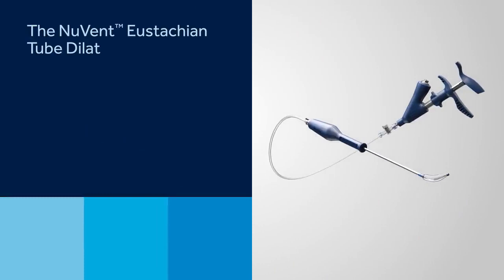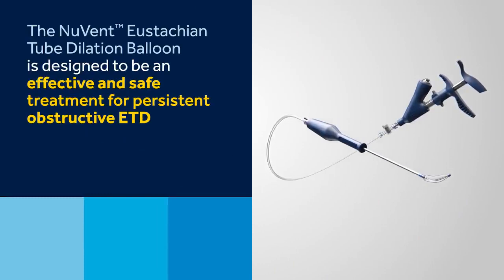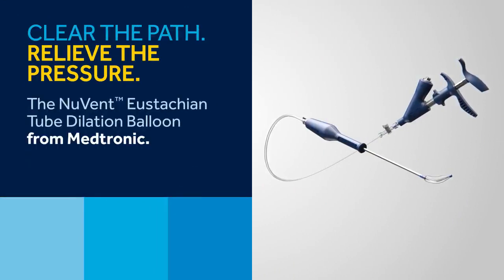The NuVent eustachian tube dilation balloon is designed to be an effective and safe treatment for persistent obstructive ETD. Clear the path, relieve the pressure.